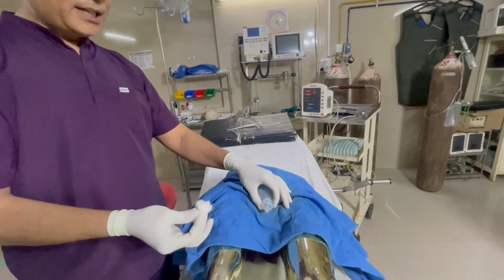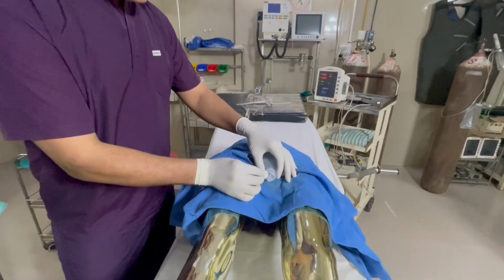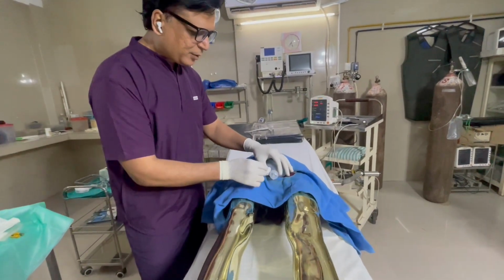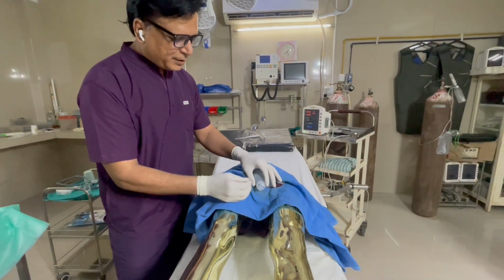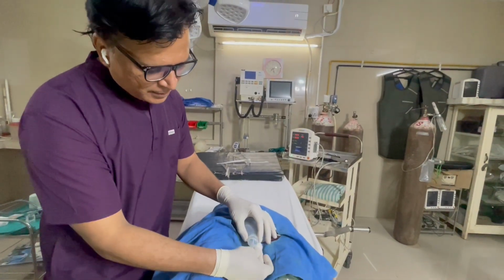If multiple swabs are there, I will throw this in the waste and then use another swab. If only a single swab is there, then I will say that I will be using multiple swabs. So first around the prepuce, then move from front to behind, four swabs like this.